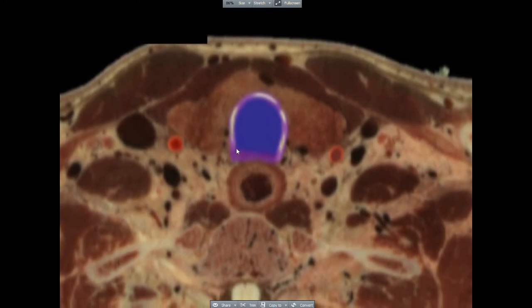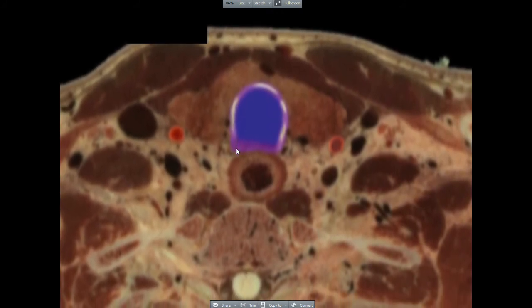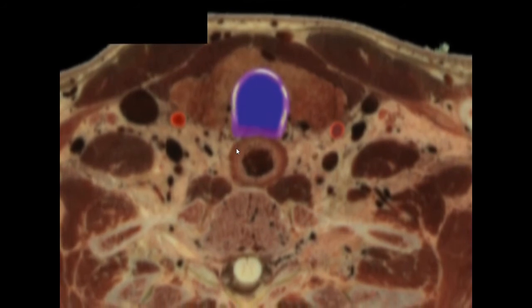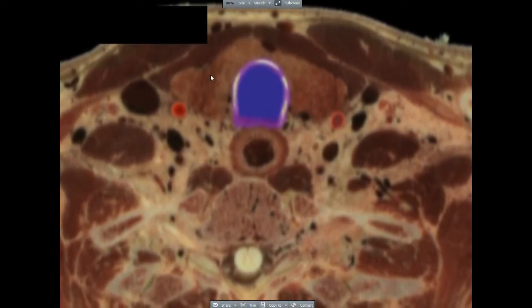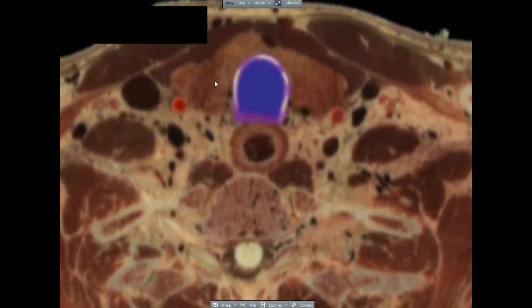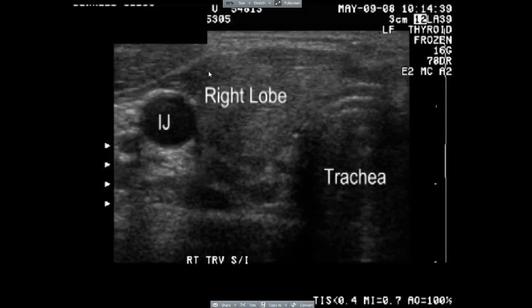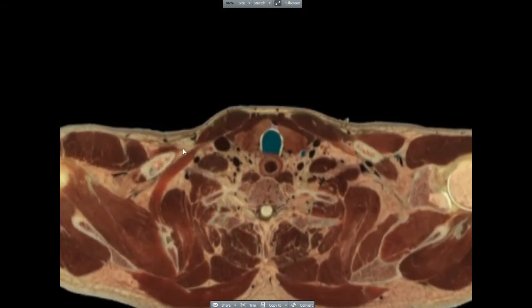Look carefully at these images from the thyroid gland in the VH Dissector cadaver. Notice that the right lobe is inhomogeneous compared to the left. Again, orient yourself. The internal jugular vein, the trachea, and the right lobe are clearly seen here.